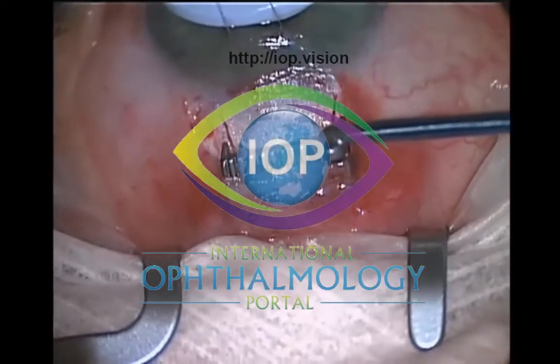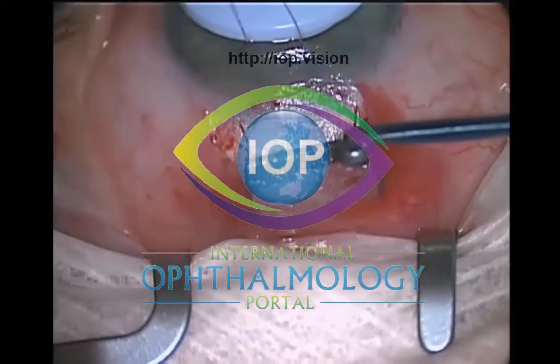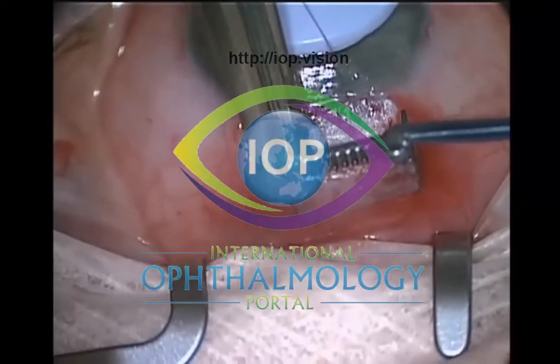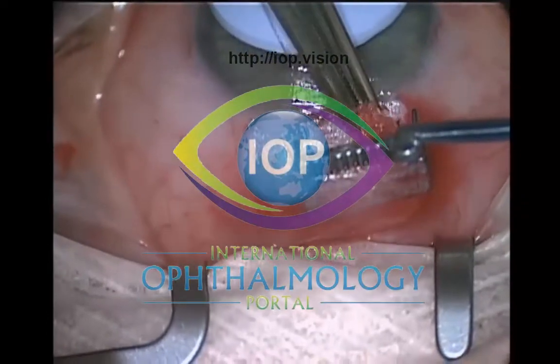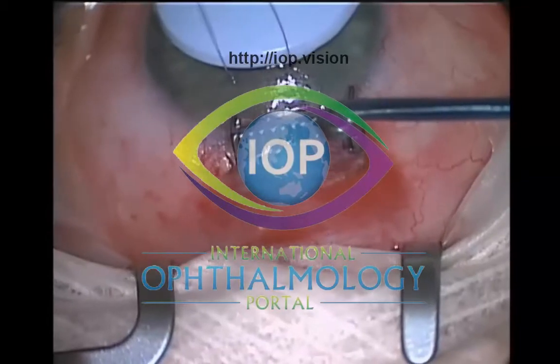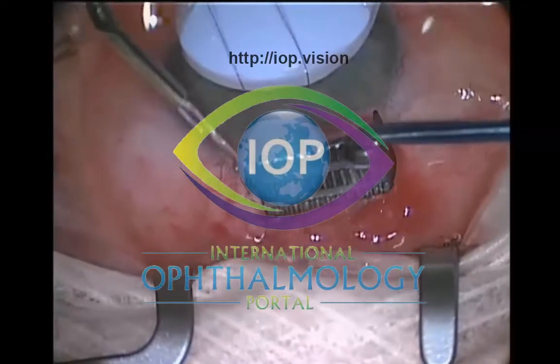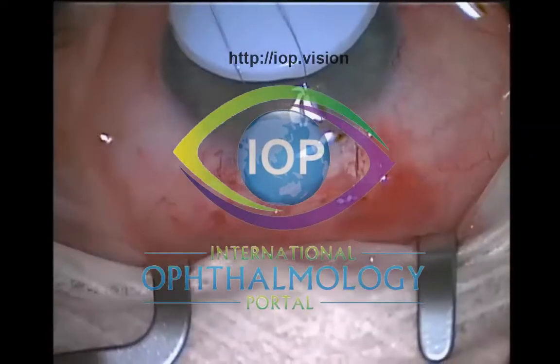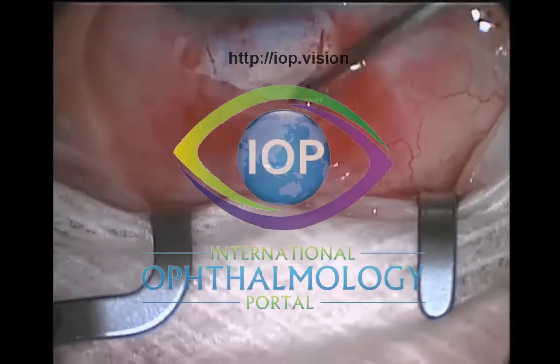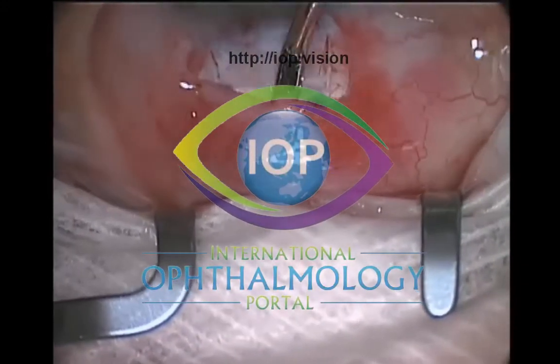And you can see the conjunctival retractor itself, the top edge of it is a bit serrated so that it actually grips the tissue, so it doesn't just slip off. It took a while to actually design the retractor, the height and the width of the retractor, just to have it just the right size so that it's able to hold the conjunctiva according to the initial conjunctival incision size. Certainly if you have a smaller conjunctival incision, the retractor won't fit. If you have a larger incision size, the conjunctival retractor won't hold the tissue as well.